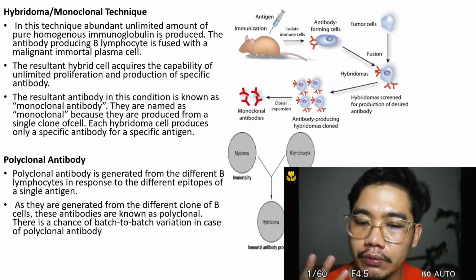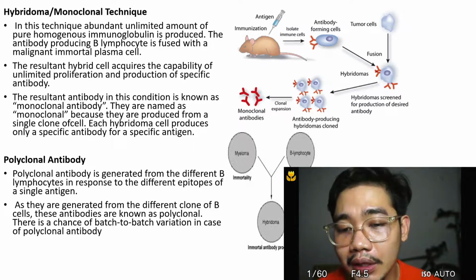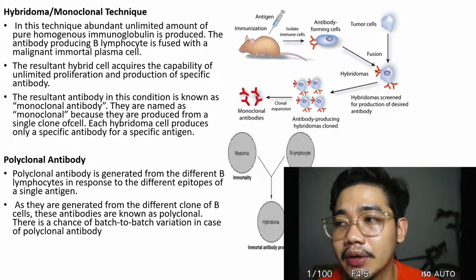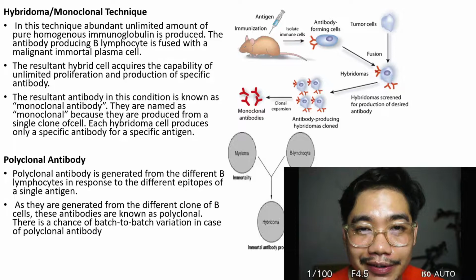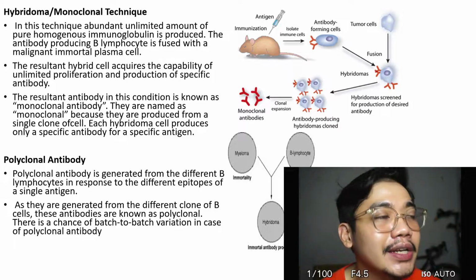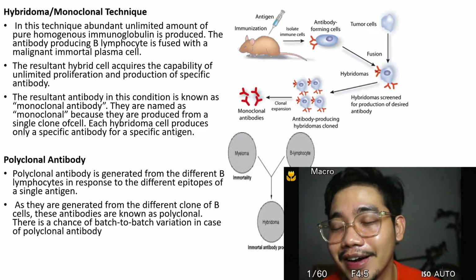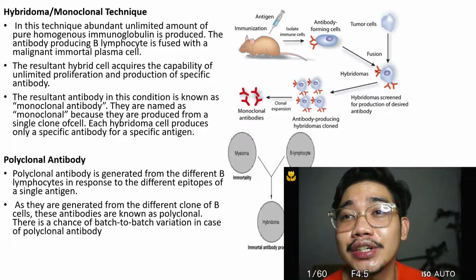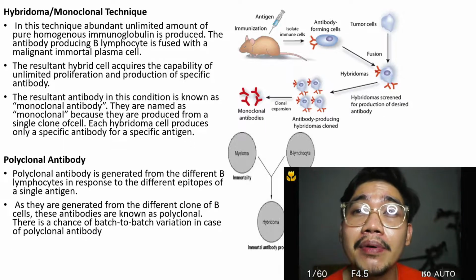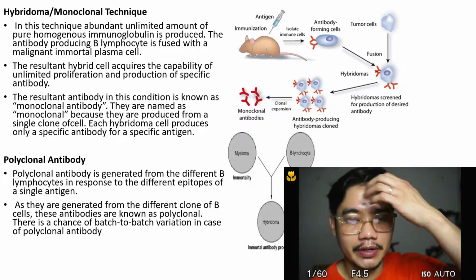The mere fact that an antigen attaches to an antibody is hard to fathom, because it happens at the level of molecules. It's not like threading a needle. It's like a key and lock, but even finer than dust. It's very complex, and dependent on multiple variables.